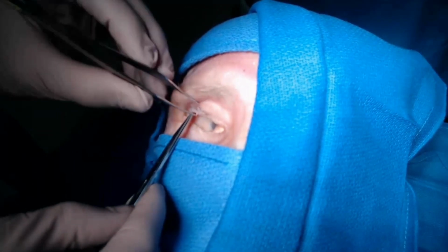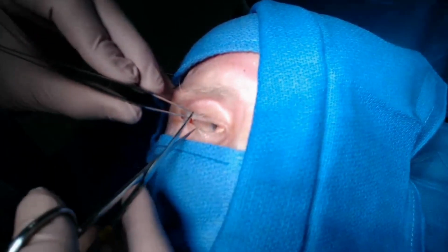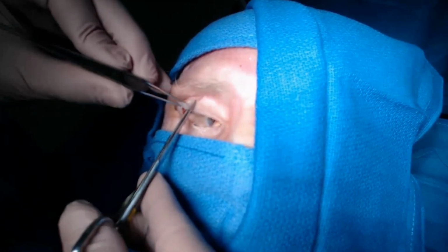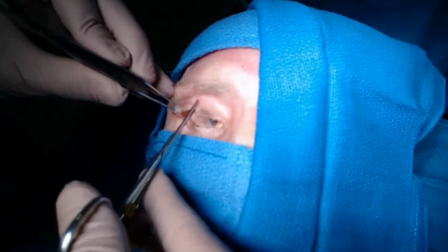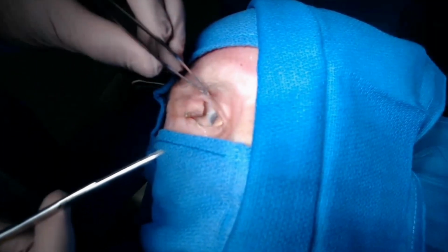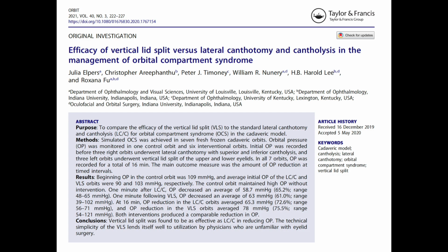A full thickness upper eyelid incision is made using tenotomy scissors or straight iris scissors, 3 to 4 millimeters from the lateral canthus and extending 8 to 10 millimeters away from the lid margin. If the IOP does not adequately decrease, a corresponding 7 to 8 millimeter incision can be made in the lower eyelid. This technique has been shown to adequately decrease ocular pressure, particularly in cases when the traditional canthotomy and cantholysis cannot safely be accomplished in a timely fashion.